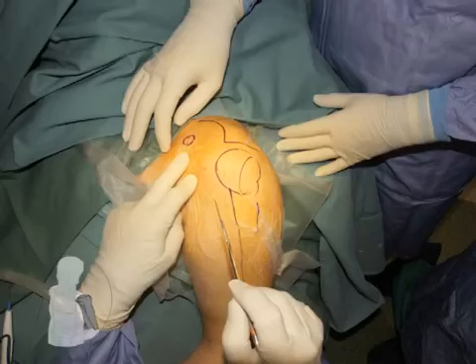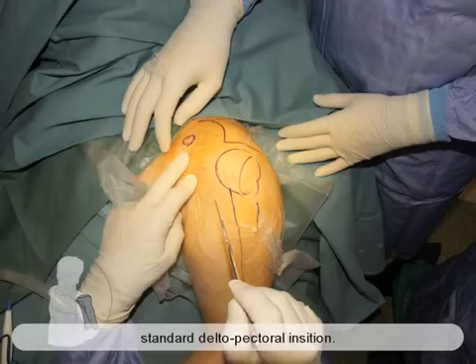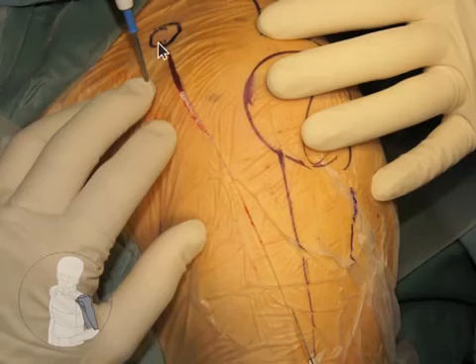Planning out our patient, the patient has been prepped and draped. The bony landmarks have been shown on the surface of the skin, and we'll be planning a standard deltopectoral incision. You see here going from the coracoid, extending out distally to the insertion of the deltoid tubercle. That is our standard deltopectoral incision.